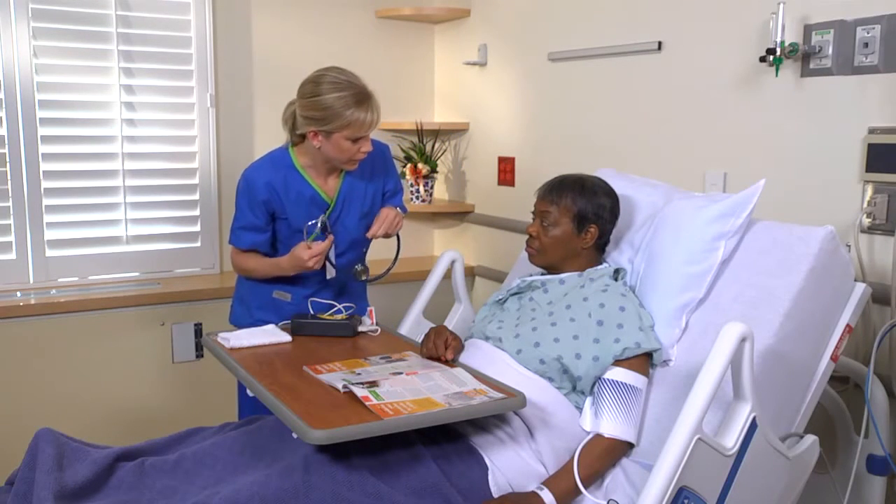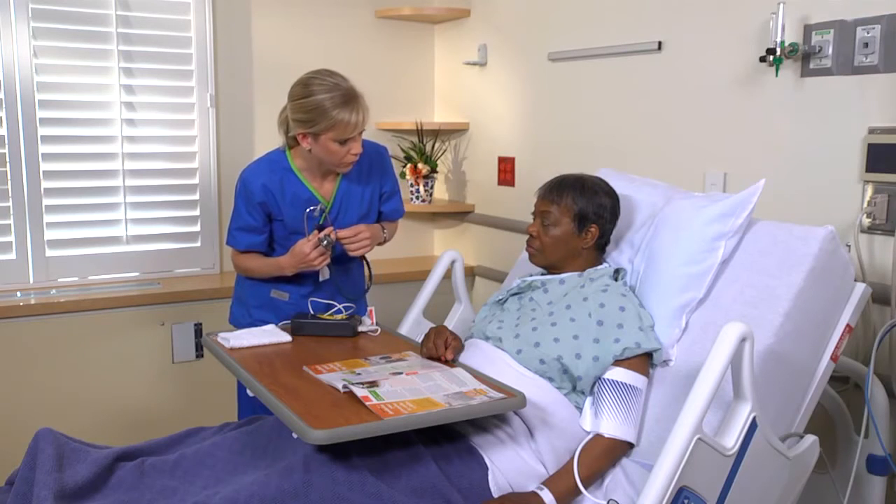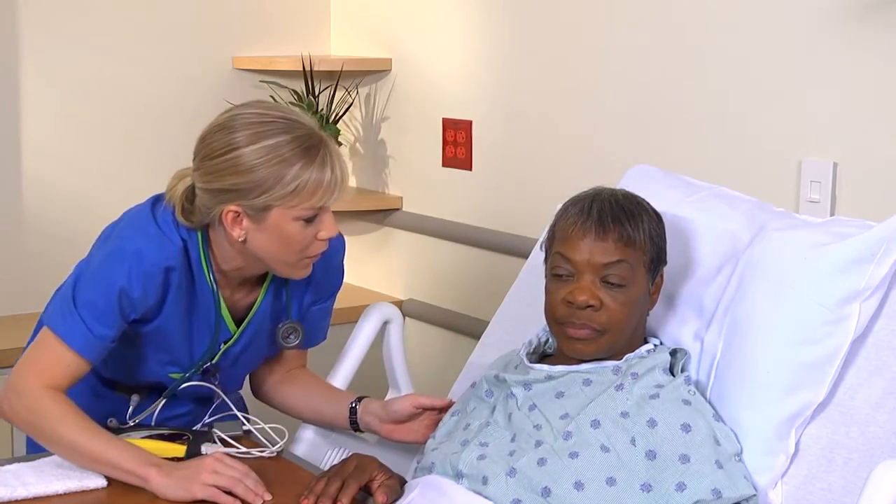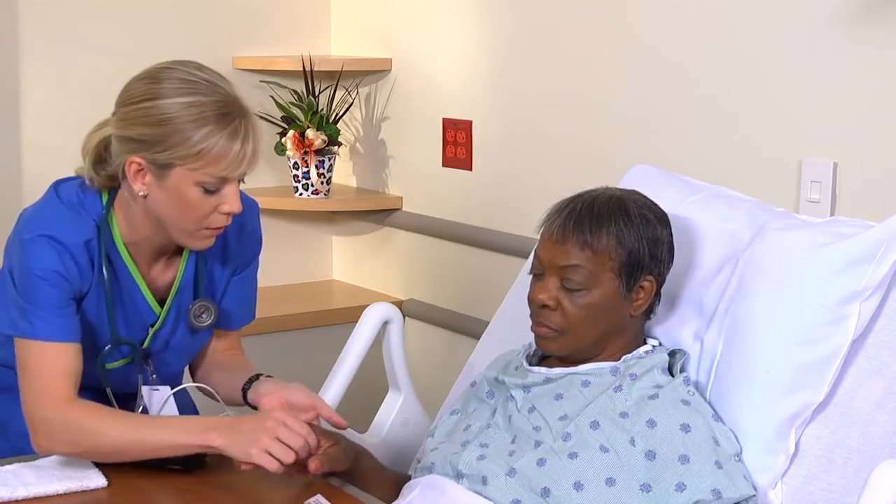I'd also like to put a pulse oximeter on you to see how much oxygen is in your blood. Then, select a site to place the sensor, such as the patient's earlobe, the forehead, the bridge of the nose, or a finger.